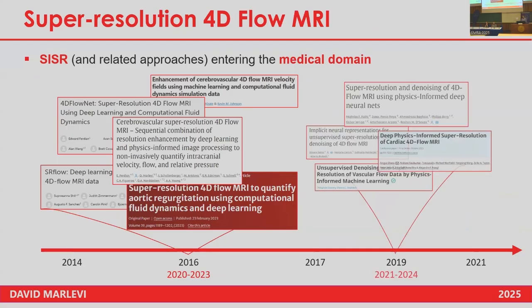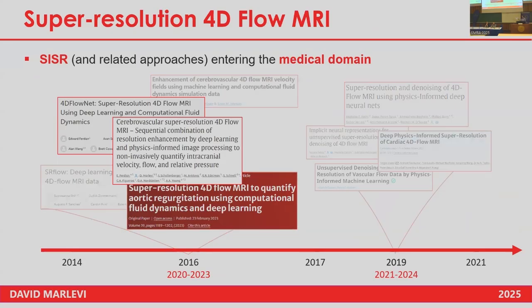We're also seeing a few works in the last few years utilizing what's called PINNs, or physics-informed neural networks. So we are maybe lagging 5 or 10 years behind the computer vision crowd, but they are the ones also developing these techniques. I will focus a little bit on this domain here, namely utilizing residual networks to enhance resolution, and span a little bit beyond that towards the end.